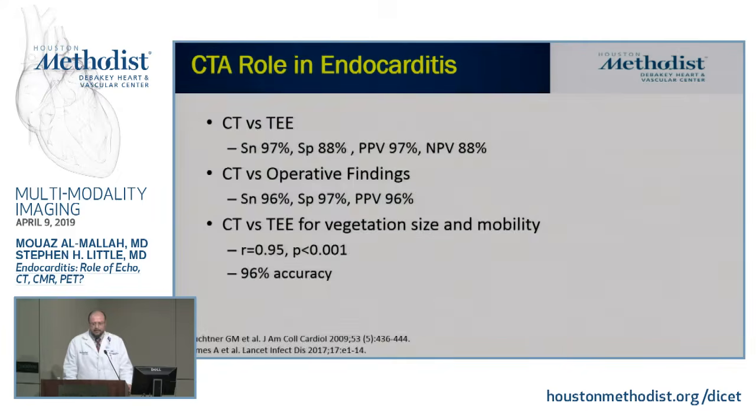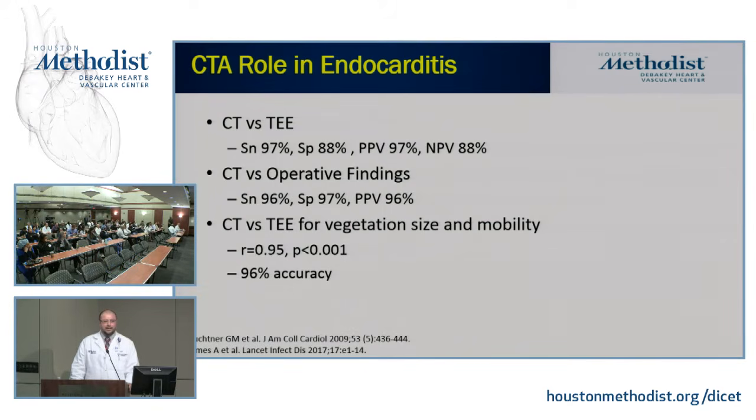But you've got to be careful about number two, because once you go to operating, the abnormalities are so large. Yeah, but still, with sensitivity, it did not change much, but negative predictive value is about 88%. So something very important to keep in mind is that if you don't see it, there's still about 12% that it's there. So it's always important to look at other imaging modalities.